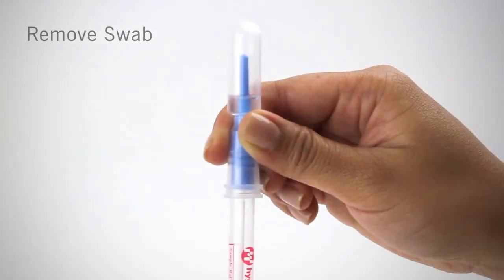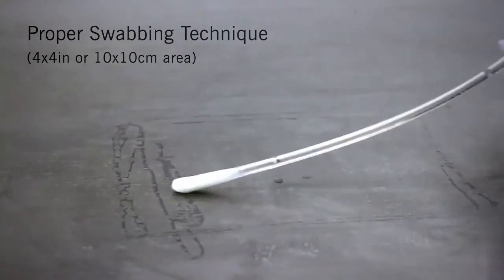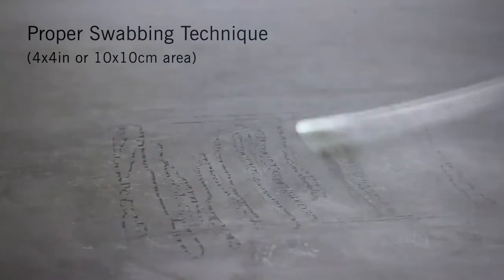Now let's see how it works. The first step is collection. Remove the swab from the tube. Swab a 4 by 4 inch square area in a zig-zag pattern, swabbing the area with even coverage.